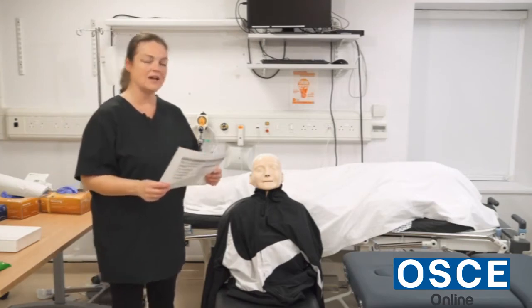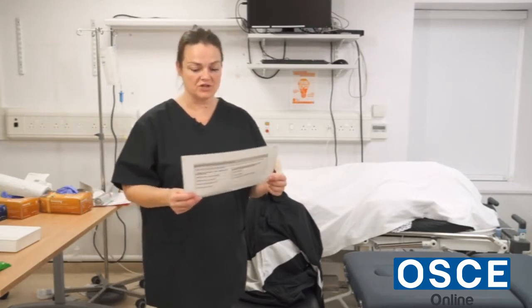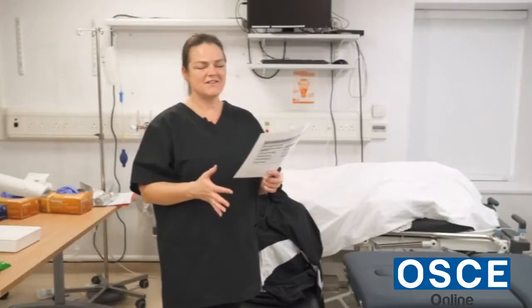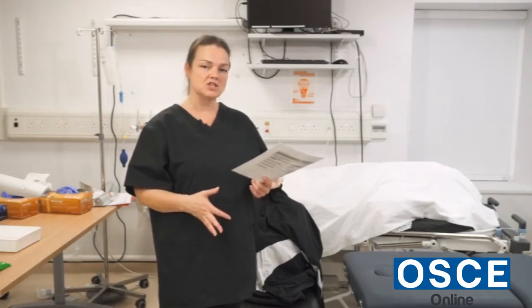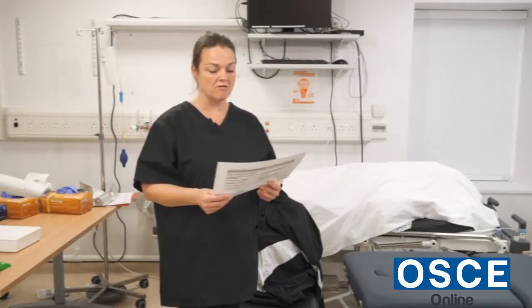So I'm here to give you this inhaled medication called salbutamol. It's an inhaled medication which comes through an inhaler device called a spacer. This is to help you get the full benefit of the medication. Have you taken salbutamol before? Yes, I think so. So the benefits of it is it'll open up your airways and help you to breathe more easily. The side effects can be a rapid heart rate, you can feel a little bit shaky, a dry mouth, but these are temporary and quite common symptoms which do wear off.